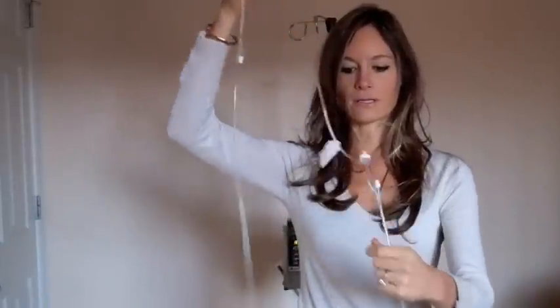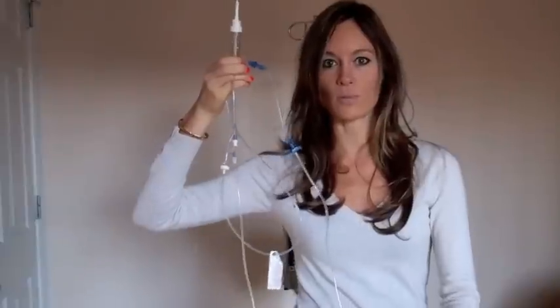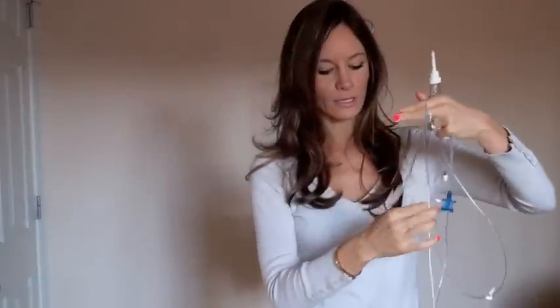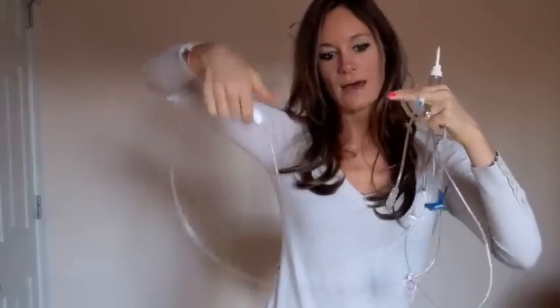The IV tubing usually comes packaged like this. This is what it looks like when it's opened. You have the end here with the empty chamber because we haven't put fluid in it yet. Going down, we have this part that hooks into this particular pump. We are using an Alaris pump — every pump is a little bit different, but they all have the same concept. You have a little clamp down here that you can roll up to open or close, and then you have the tip here that you connect to your patient.